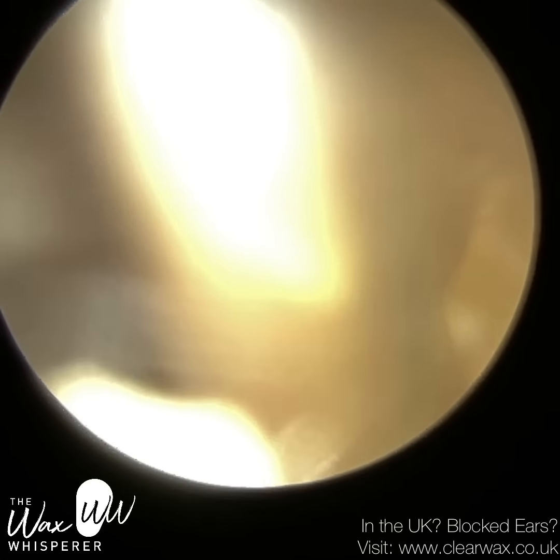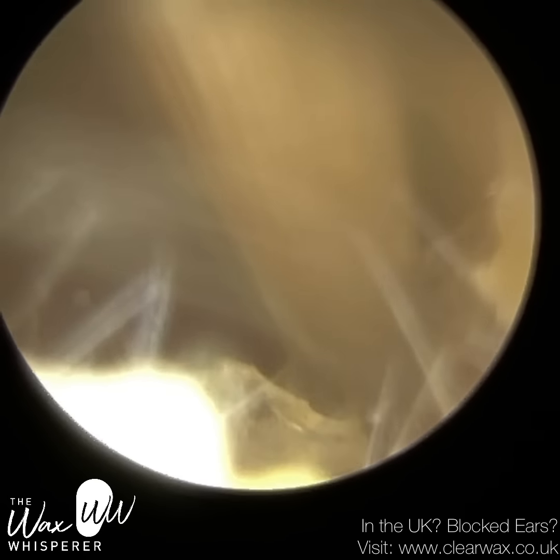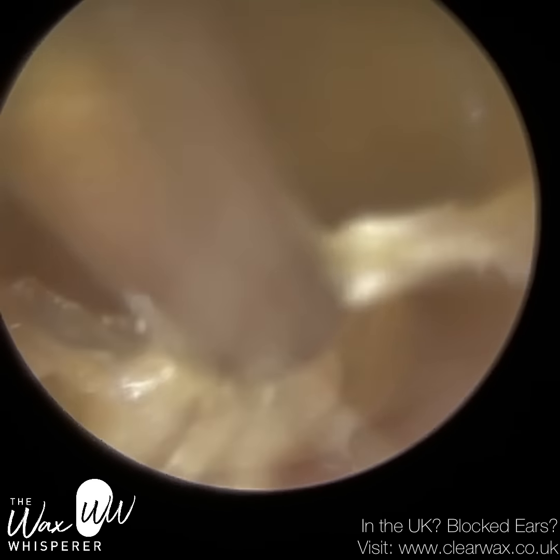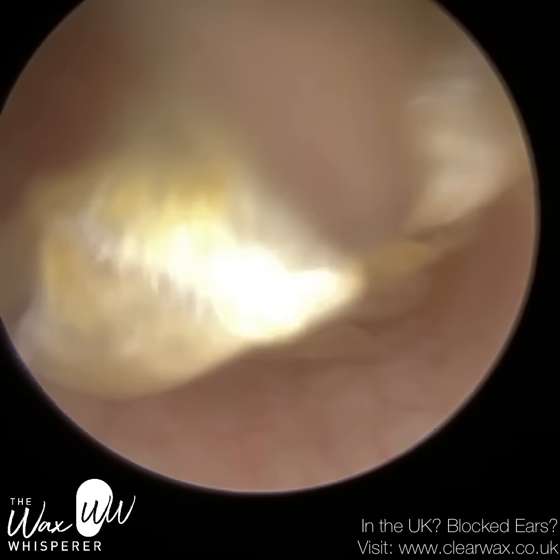So I'm just at the bottom here, just peeling this away. So there's still quite a lot of dead skin to peel. You'd be surprised how much we actually peel away. So do continue watching if you enjoy your skin peels. You can see the oil's done its job here. It's just really softened this. I'm just peeling this away.